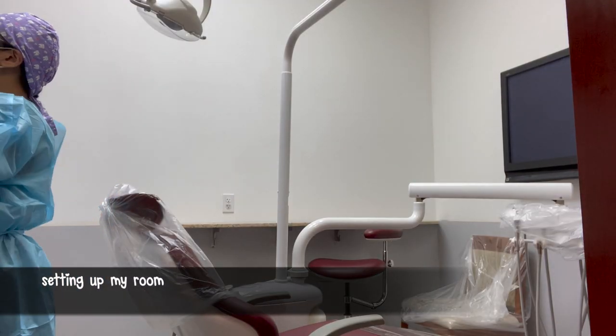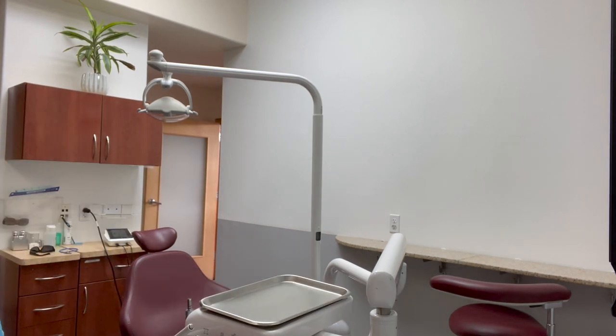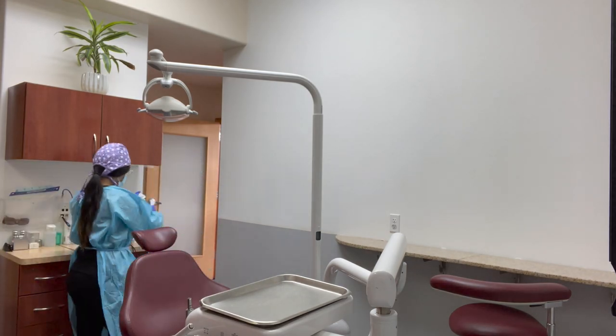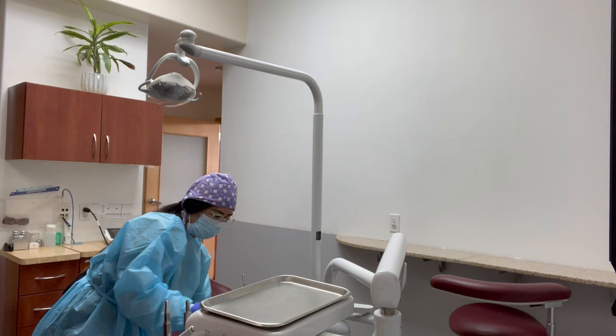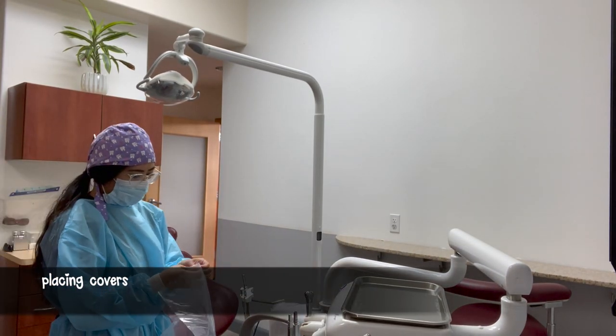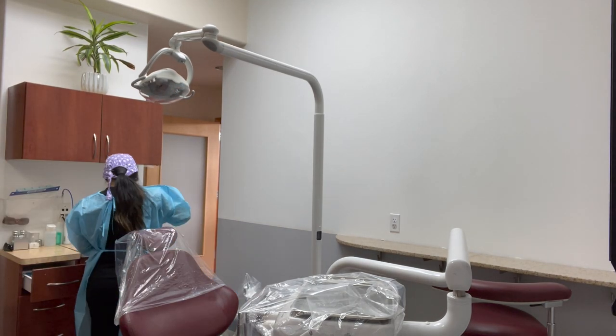I am starting off by setting up my room. You guys can see the chair that I am working out of for the rest of today. I sprayed the entire room down and now I am using CaviCide wipes to wipe everything — here I am wiping the light covers, all of the hand pieces, the tray, and the chairs.